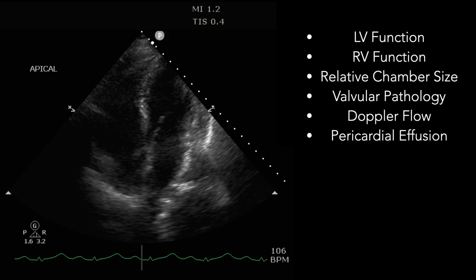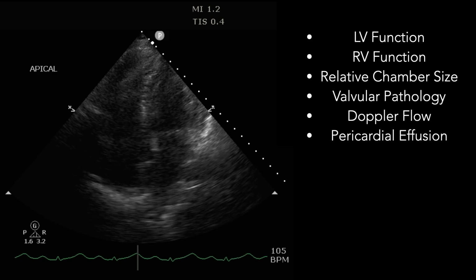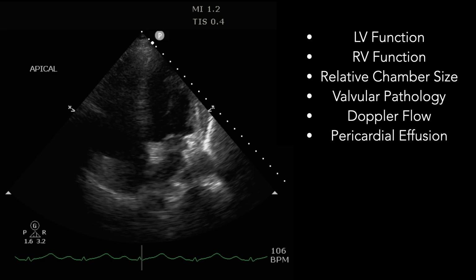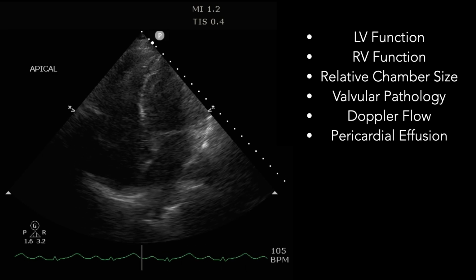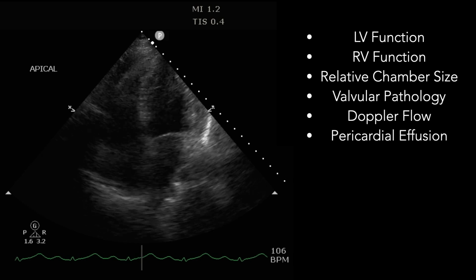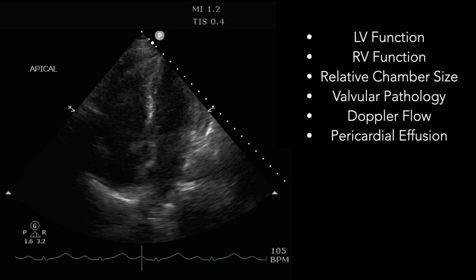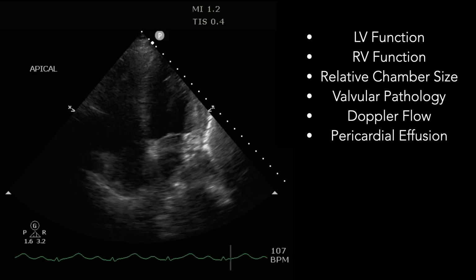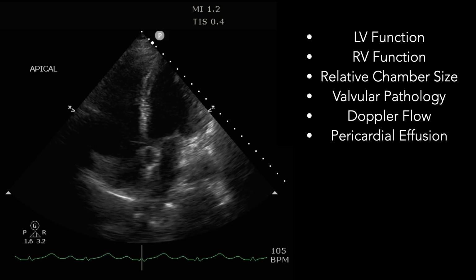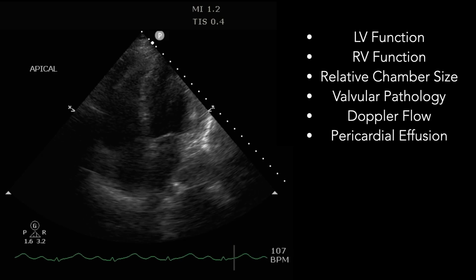And so one of the things that makes Doppler imaging more accurate is when you align the beam of the ultrasound with the direction of movement. If you're at 90 degrees from the direction of movement, you're not going to get any appreciable movement because it requires some trigonometry where the cosine of an angle theta is 90. When you do that math, it equals 0. So it cancels out all the calibrations that you do with the trigonometry.